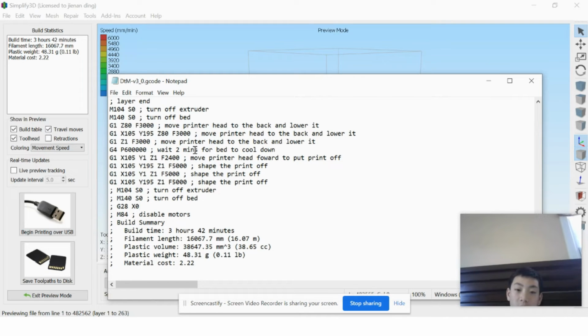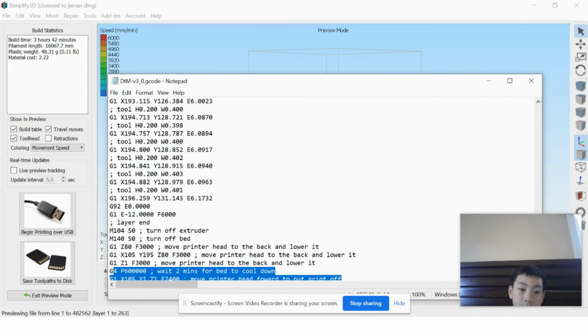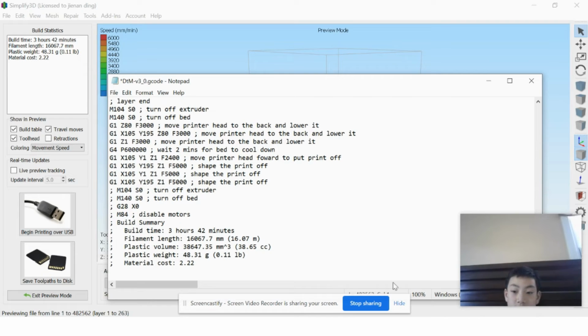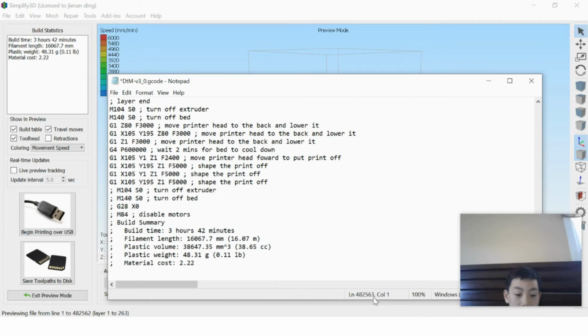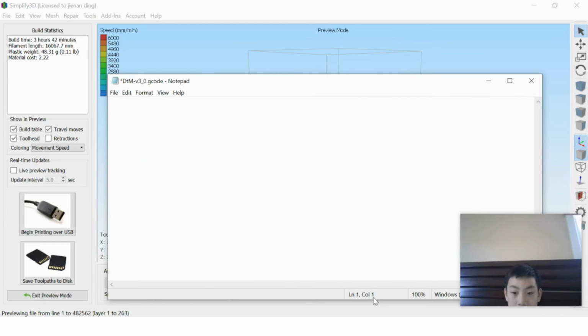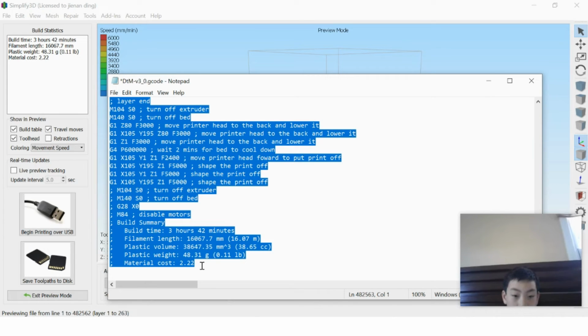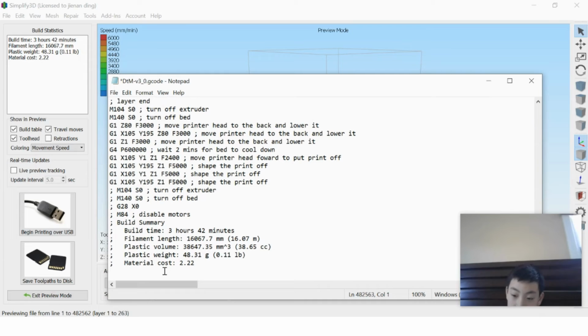Since you don't want only one print, maybe 2 or something, you're going to highlight the whole thing. Just Control A, then Control C to copy it, and then Control V to paste it. Before, it was only this much. Now I Control A, copy it, press Enter to make a space there, and then paste. So now it's 9,000 lines. It doubled.